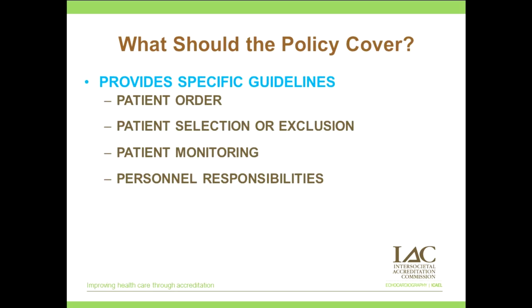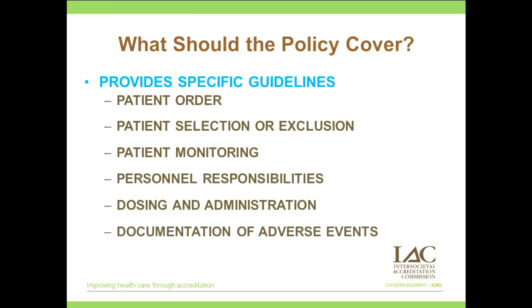It will address the question of who does what, who starts the IV, and who administers the contrast. How much contrast do you give? And what method does your lab want to use? And finally, what kind of documentation the lab requires for adverse effects and allergic reactions. Your policy will cover all of these components, providing the sonographers with specific guidelines.